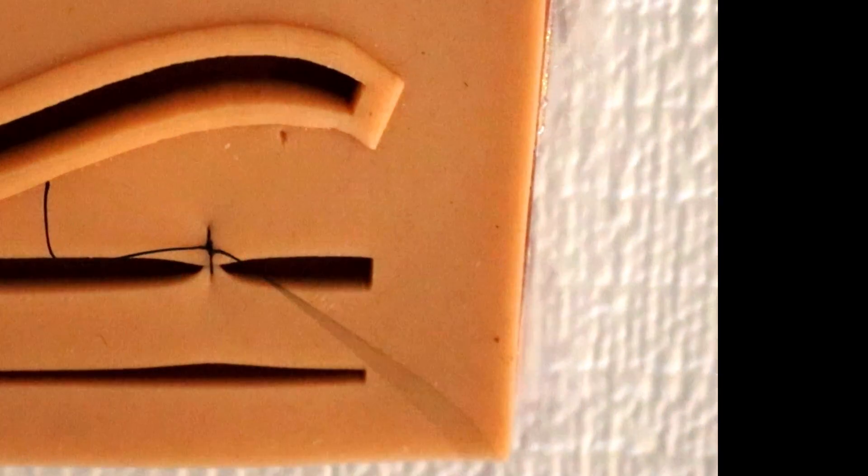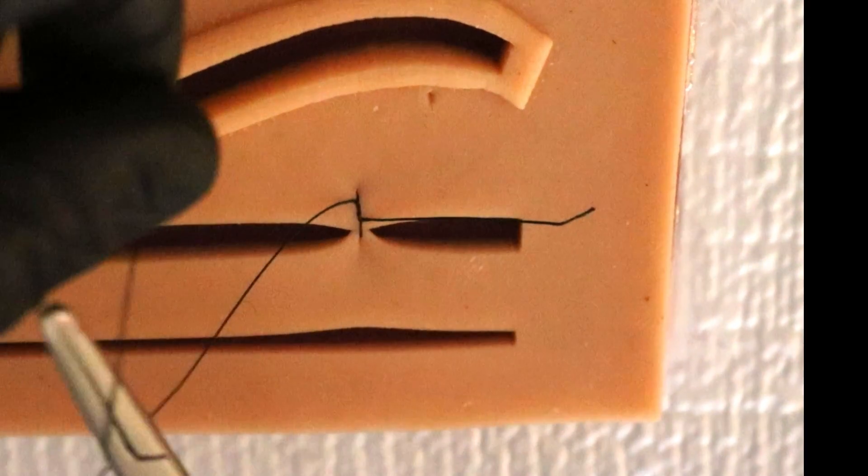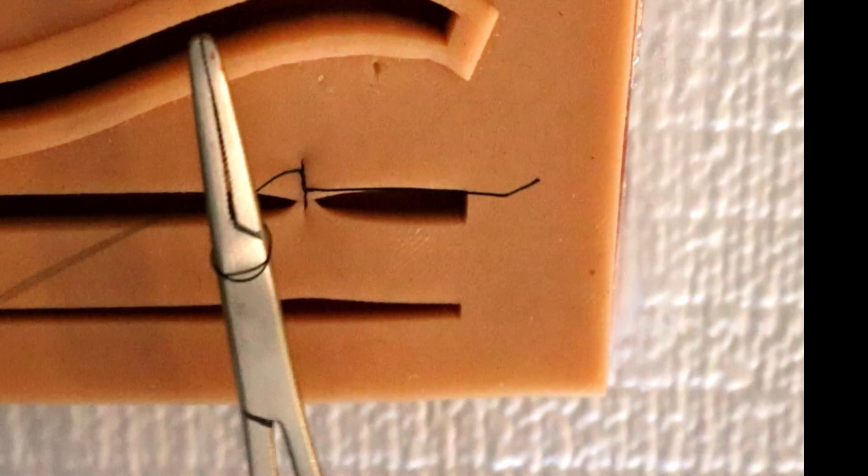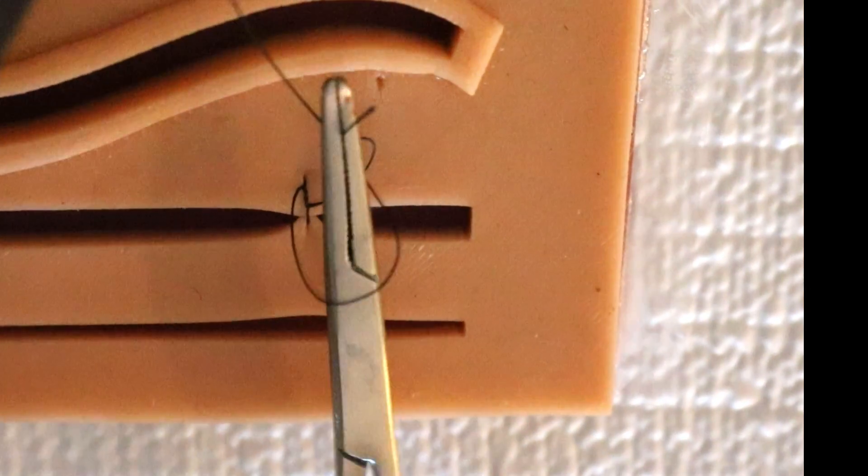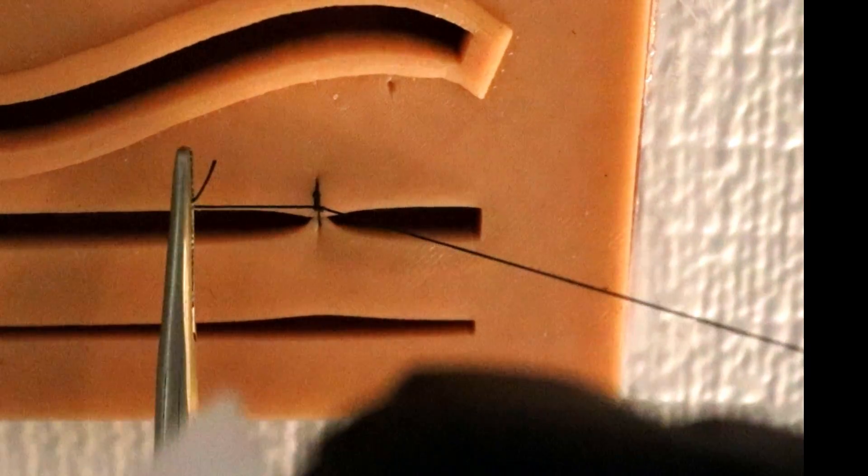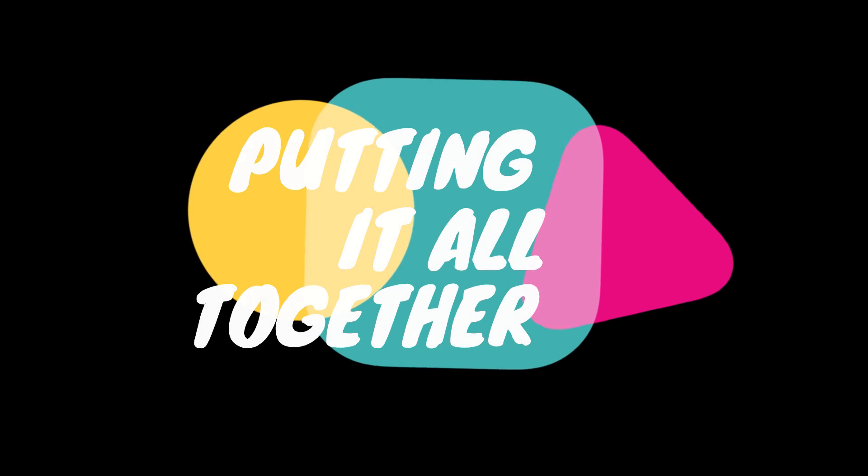Well usually about two inches two and a half inches is probably good for your beginners. You can see this is my third throw here but you can see my tail is much shorter just because I've done thousands of these so you get kind of good. But the concern always with a short tail is you might accidentally pull that suture right through and have to restart.